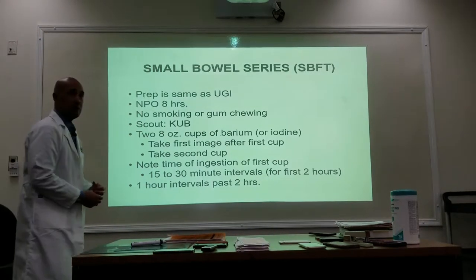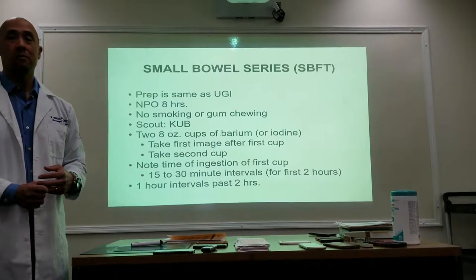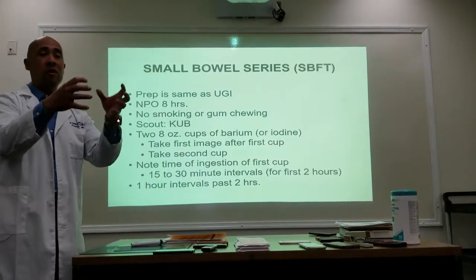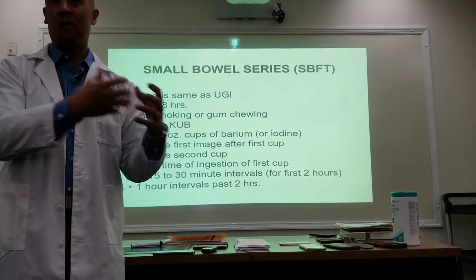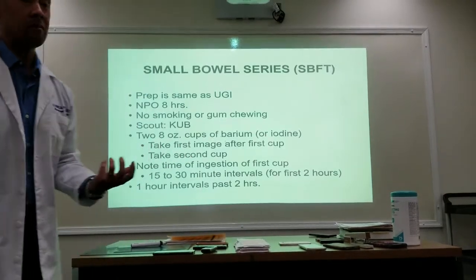Professor, question, when we have our 2 8-ounce cups ready, eventually it settles. So do we need to... Yeah, so the question was, do we need to, yes. If we're preparing the cup of barium, what you actually should not do is pour it in the cup. Leave it in the jug or in the container, and don't pour it in the cup until they're ready to drink it. Okay? Thanks.